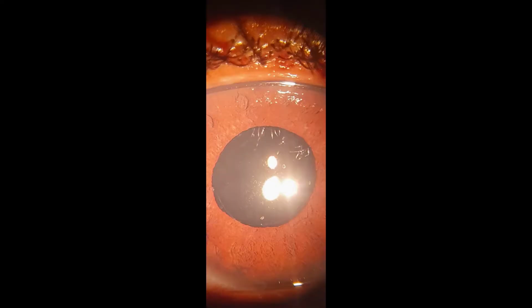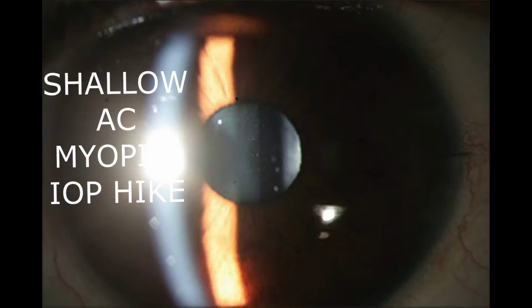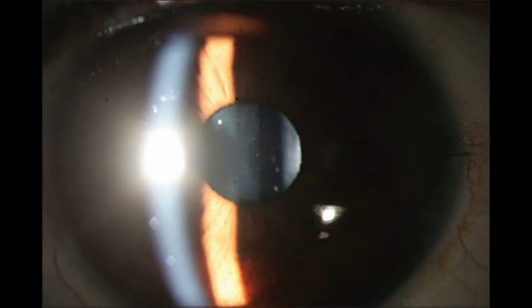Early capsular distension syndrome is associated with retained OVD in the bag posterior to the anteriorly displaced intraocular lens. This results in a shallow anterior chamber, myopic shift, and a hike in intraocular pressure.